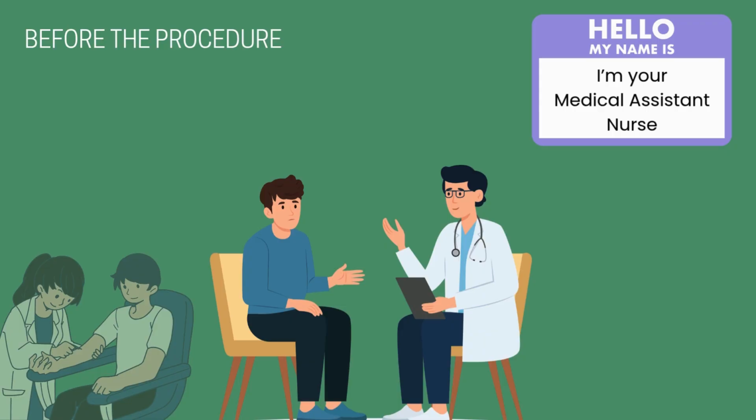Always ask permission before touching their arm and pay attention to body language. Clenching the fists or pulling back of the shoulders may mean the patient is anxious or scared. Keep everything respectful, modest, and trauma-aware.